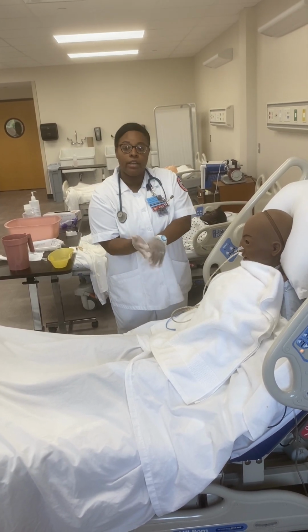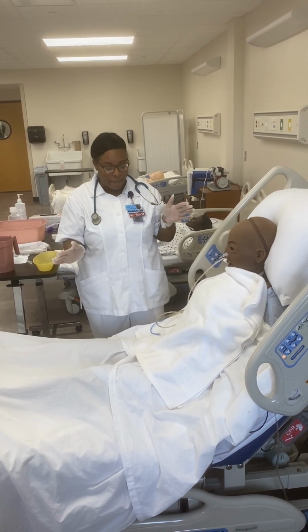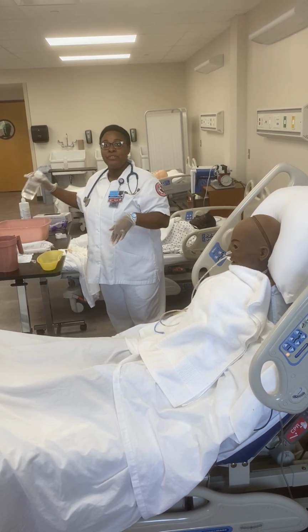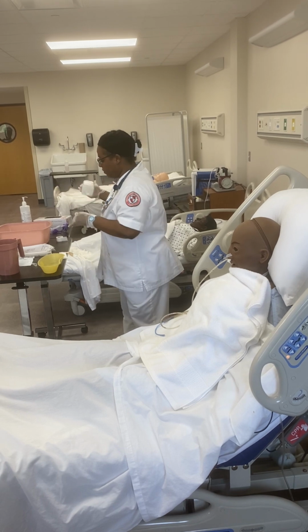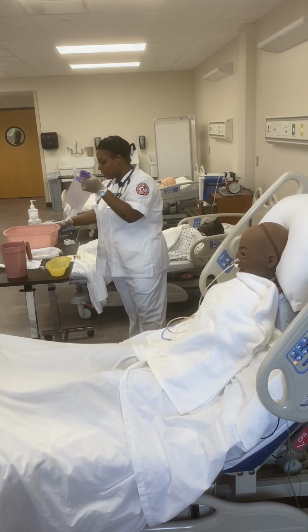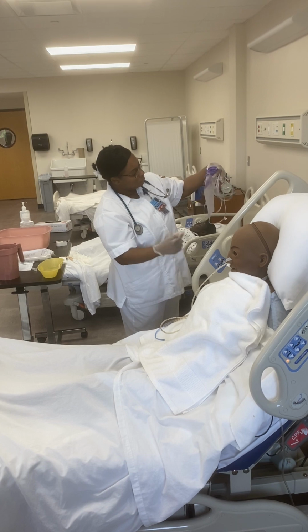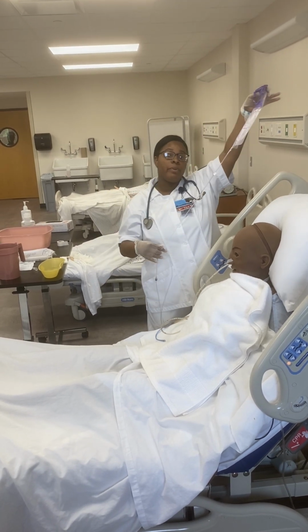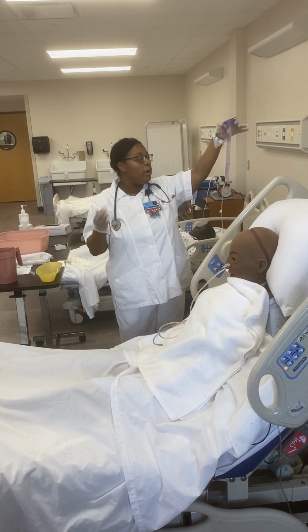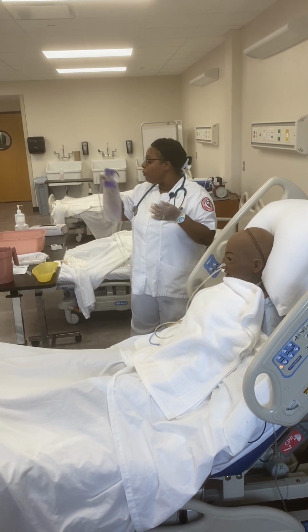All right, for enteral feeding, first thing, I already said I'm going to verify my physician's order, check my patient, identify my patient. I'm going to prepare my enteral feeding and pour it into the bag. I'm going to hang it up. If I'm going to instill it by bolus, it'll be a gravity bolus. We'll allow it to go by gravity, or we can hook it up to a feeding pump. But first, we have to check placement.